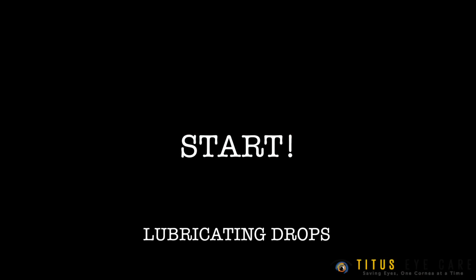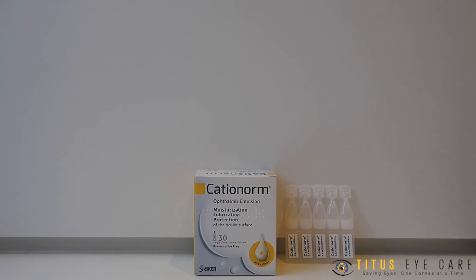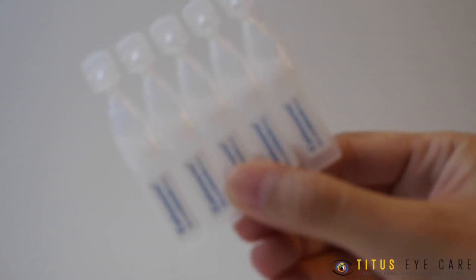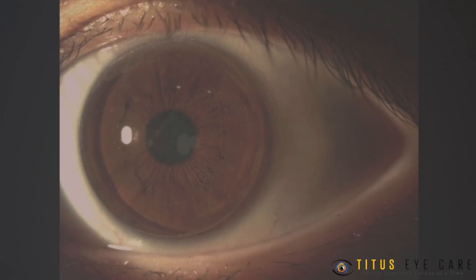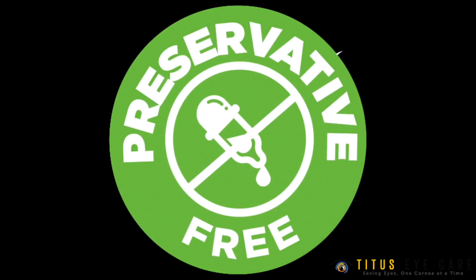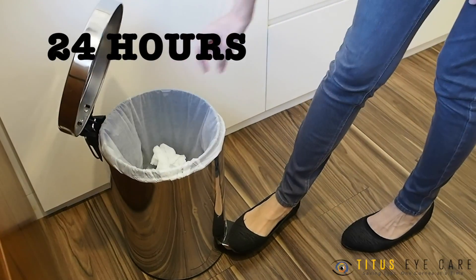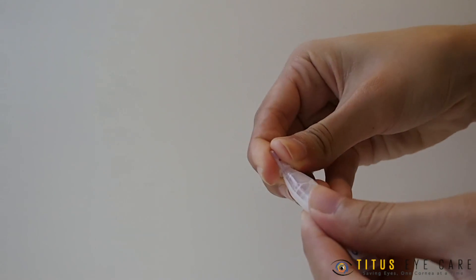We shall start with the lubricating eyedrops first. Cationorm is the lubricating eyedrop that you will need to place on your molds every night before insertion. These are preservative-free lubricants that are beneficial for your cornea as the molds stay in your eyes overnight. As it is preservative-free, do discard any remaining solution after 24 hours of opening. There is a cap for each tube that you can cap back on for later use, as long as it's within 24 hours.